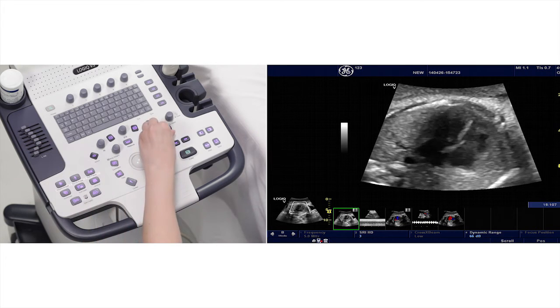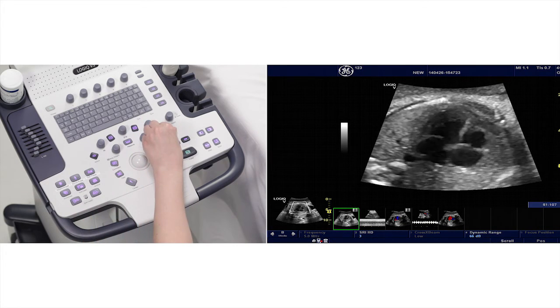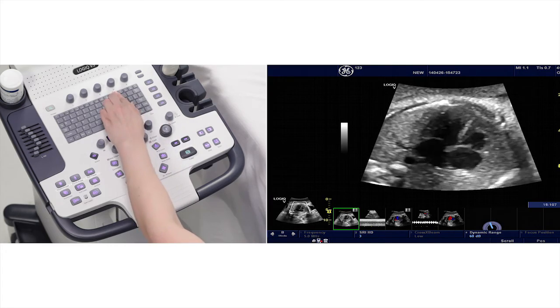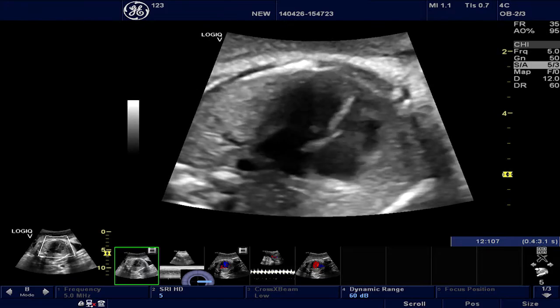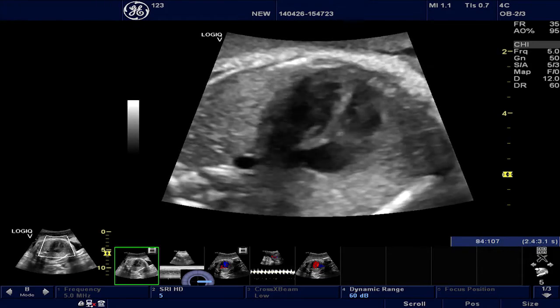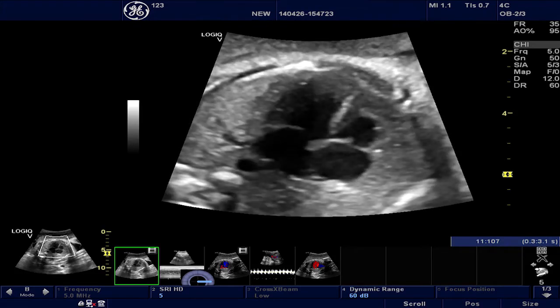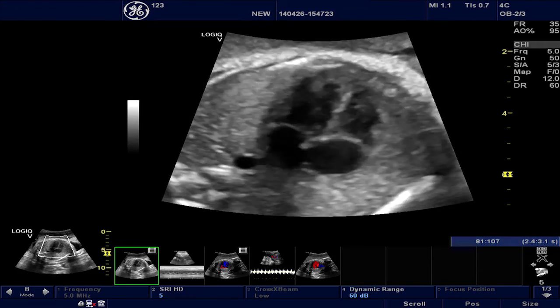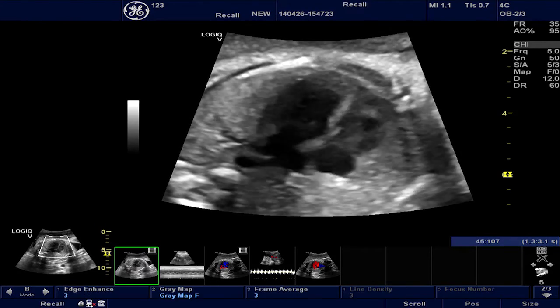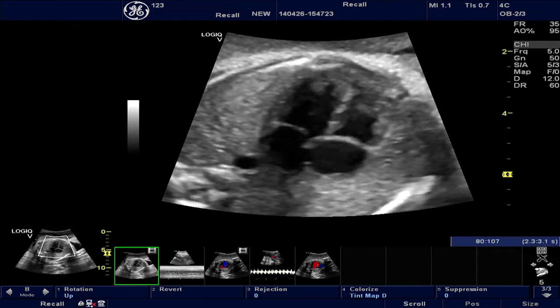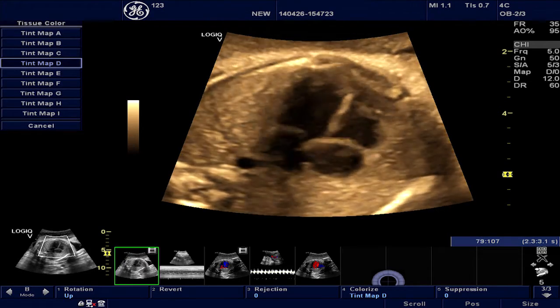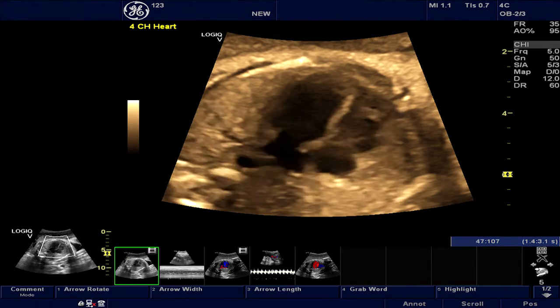Reduce posterior saturation by adjusting the TGC. Now adjust the image gain and dynamic range. The speckle noise in the image can be reduced by using the SRI function to get an enhanced image. The image can be further adjusted using the colorize option, and can now also be annotated and saved.